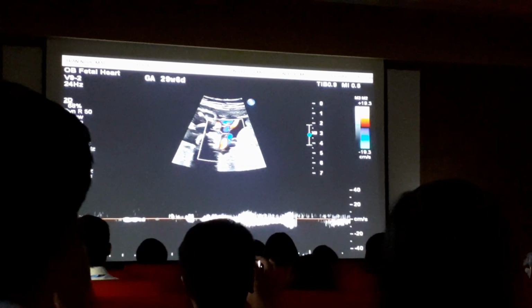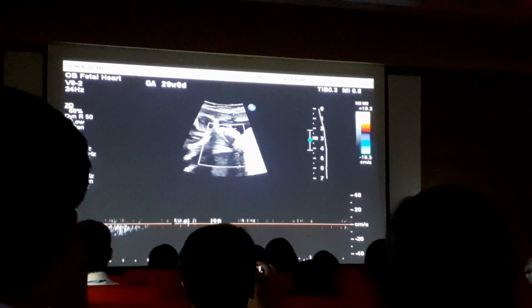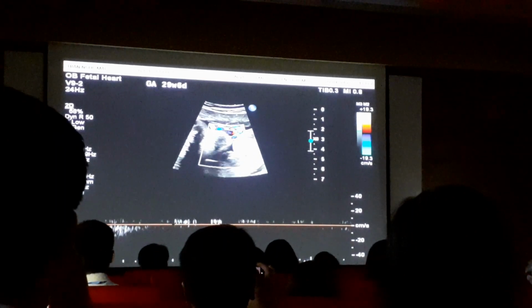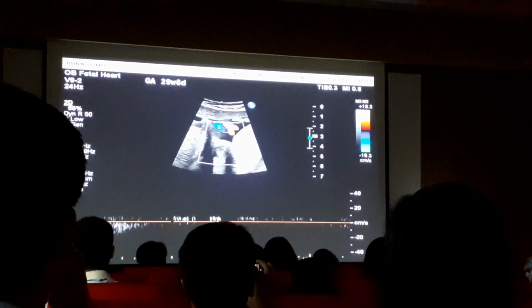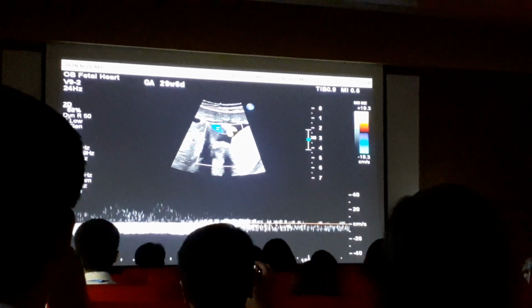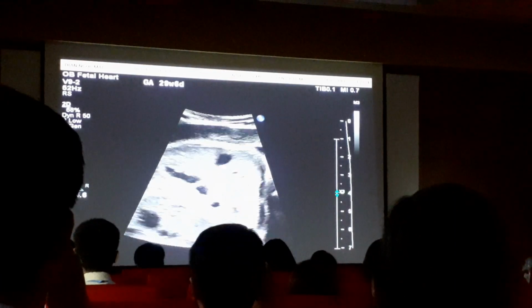Okay, look at the umbilical vein because we still are wondering why there's a function abnormality, so we need to investigate all of the venous Dopplers. Mình sẽ đánh giá cái Doppler của tĩnh mạch. And that looks normal. Cái này mình thấy là nó đi một cái đường liền chứ nó không có cái nảy mình đập, đó bình thường.